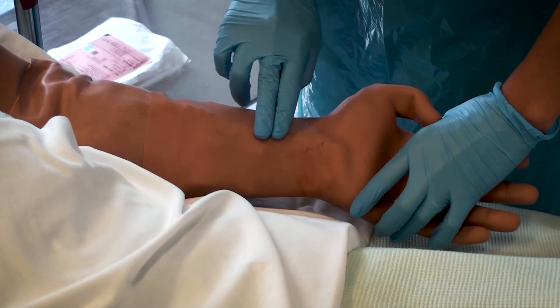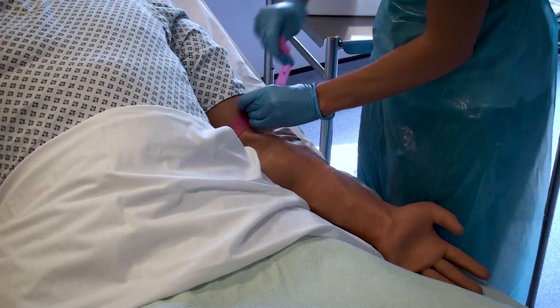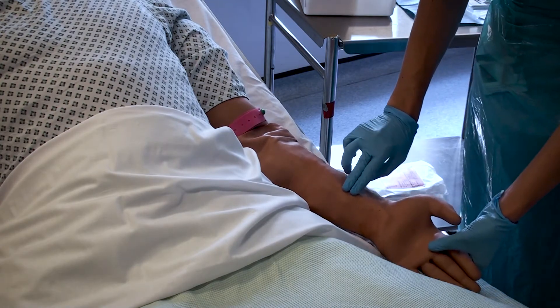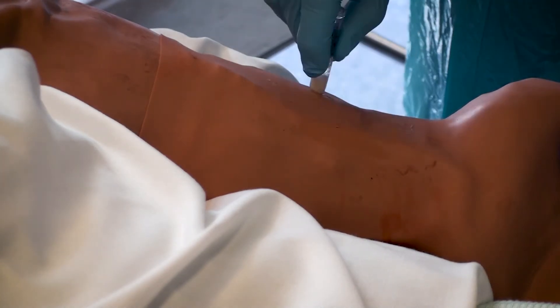Position and expose the arm and identify a suitable vein. Ideally, this should be a large forearm vein. Apply the tourniquet and once the tourniquet has been applied, re-check the vein. Ensure your patient is ready to proceed, then clean the chosen site for 30 seconds and allow it to dry for 30 seconds.